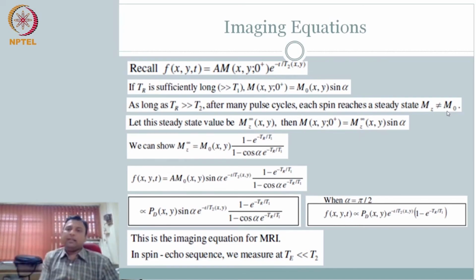and as you know, every time with any displacements, right? When you do this in dynamics, it has to have some steady state. You do this multiple times, right? Static dynamics. So when you try to push this several times, you will reach a steady state. That mz is not equilibrium, but it is a steady state. So now we will just rewrite our equations to correct for this, if you are going to repeat the experiments, right?